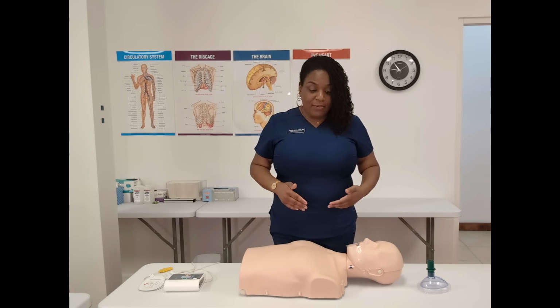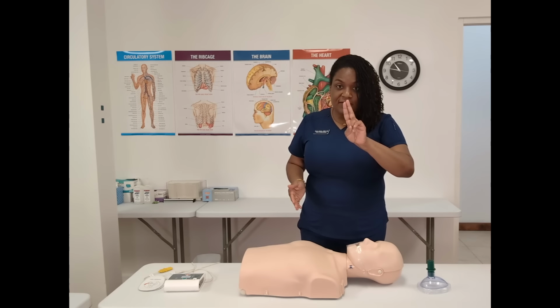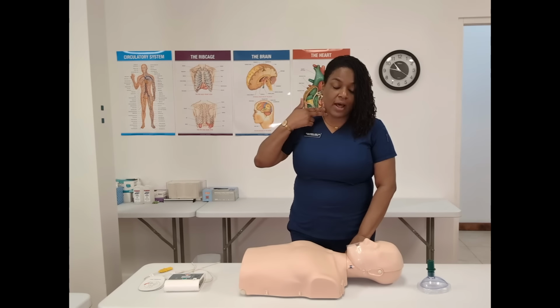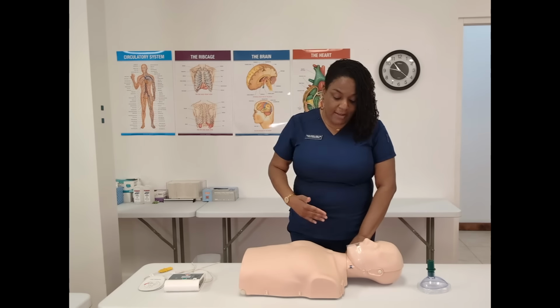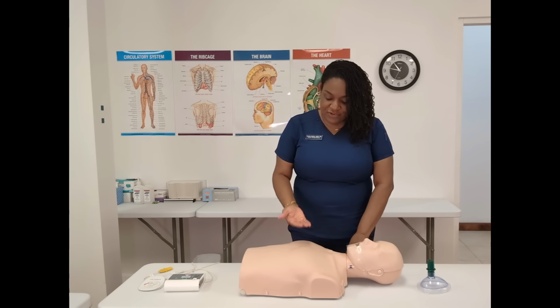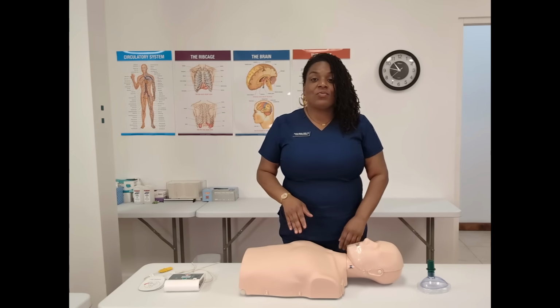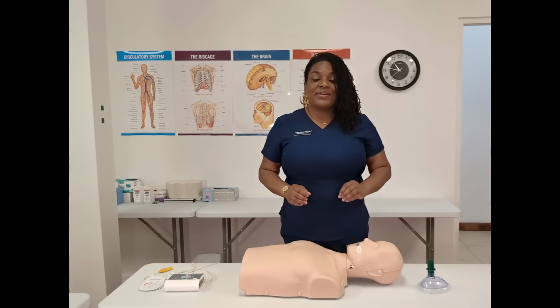And so in our instance for CPR, we're feeling for the pulse with our index and our middle finger. We're feeling on the carotid artery on the side nearest us, and we're watching for chest rise and fall. If you're old school, yes, you're putting your ear to their face, but I promise you, that's not really necessary right now. All right, so 2 fingers, carotid pulse, looking for chest rise and fall, 10 seconds max. That's right, you get 10 seconds to decide whether or not you need to render aid.